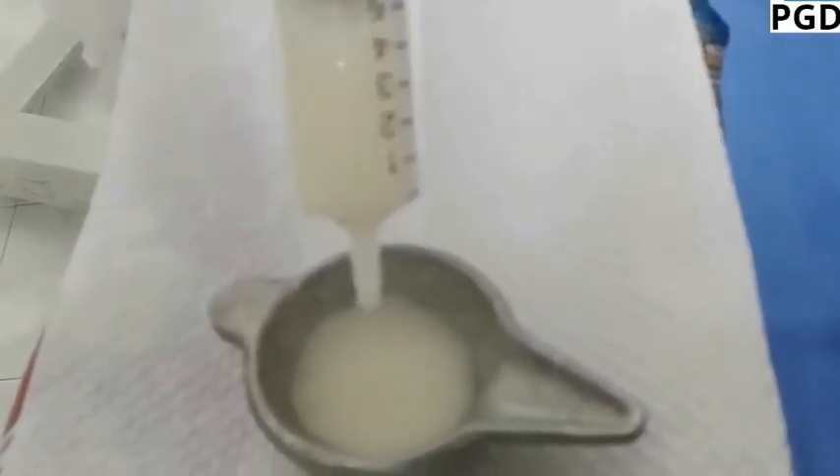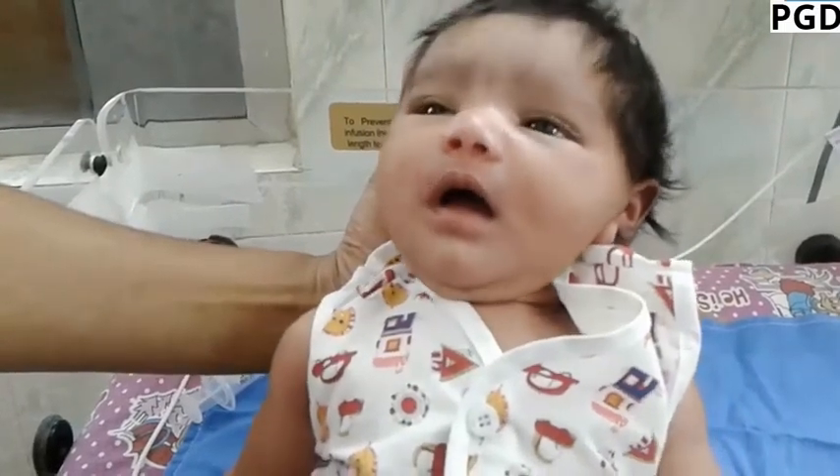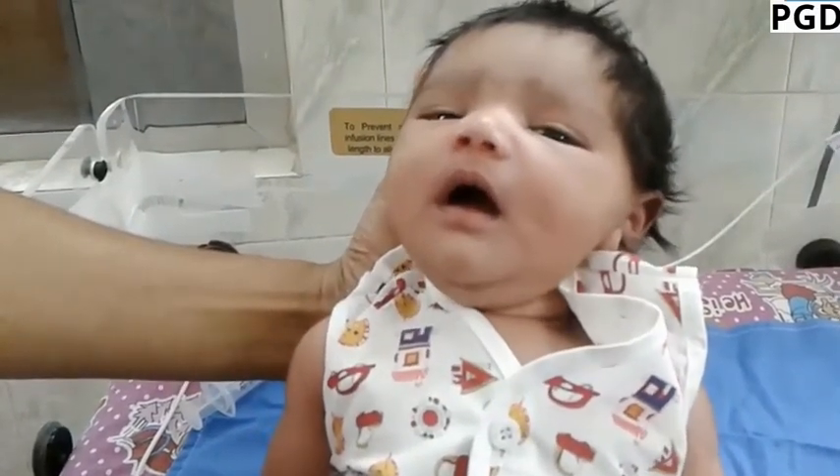Put a measured amount of milk in the paladay. The infant should be held sitting semi upright.